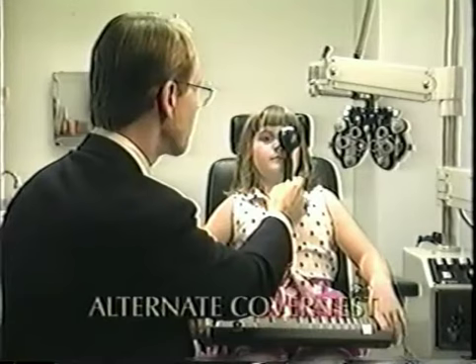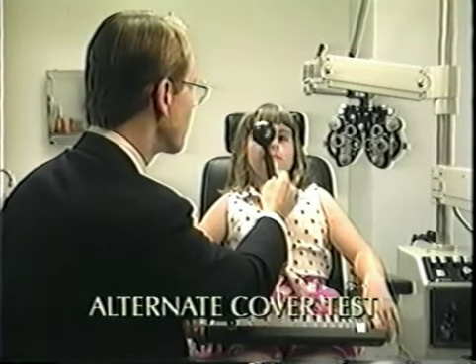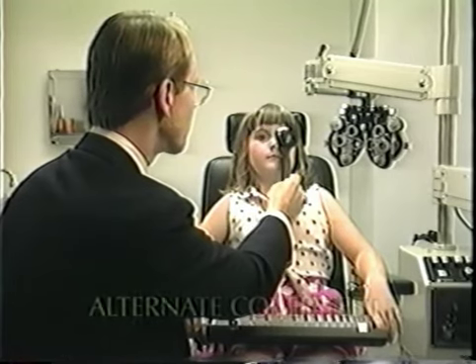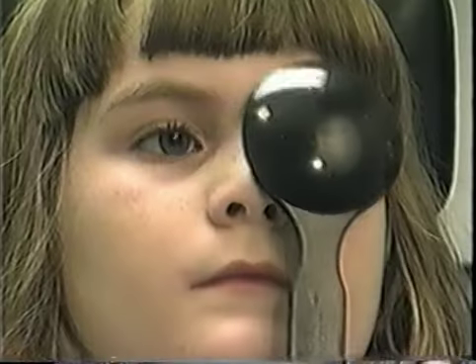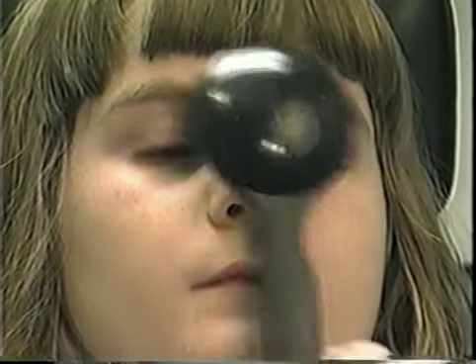Although the cover-uncover test demonstrates an ocular deviation, it doesn't quantify it. To measure the total deviation, it is necessary to perform an alternate cover test with prisms. To begin the alternate cover test, move the cover from eye to eye several times to dissociate the eyes and achieve maximum deviation. This elicits the total tropia plus phoria.